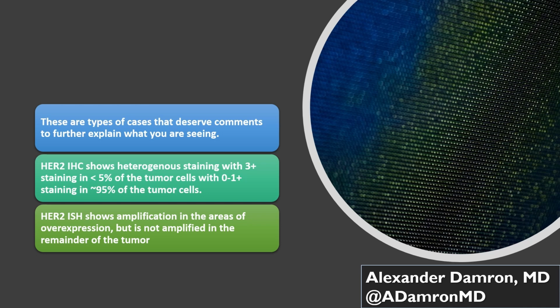And you could do the same thing with the ISH in this case, right? And they say, okay, well, when you evaluate ISH, you have to say, is the ISH greater than 10% of the tumor? And I think that becomes a very challenging thing to do on ISH, FISH, because we're counting 20 cells, and to count 20 cells as an area, is this 10% of this entire slide at the cellular level on ISH studies or FISH studies becomes very challenging, right?